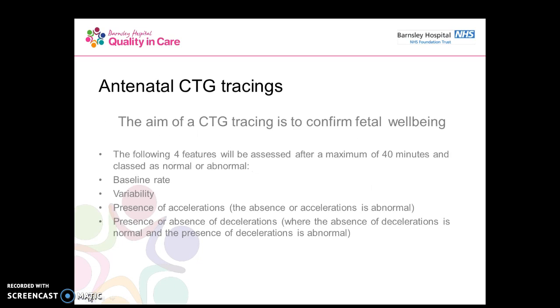Although the new NICE guidelines concentrate really on interpreting CTGs in labour, I just want to spend a couple of slides talking about interpretation of antenatal CTGs. So these are CTGs of women that are not in labour and not really having any contractions.